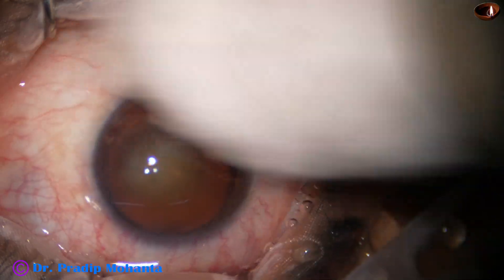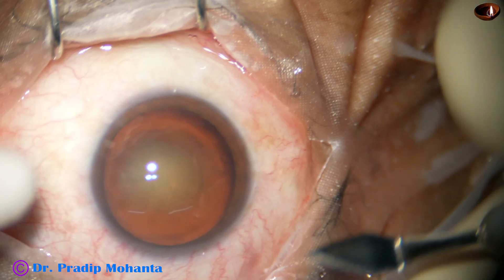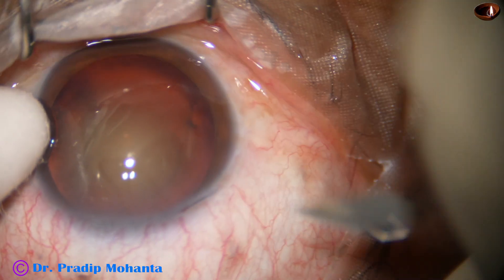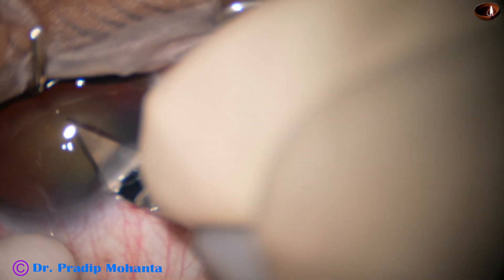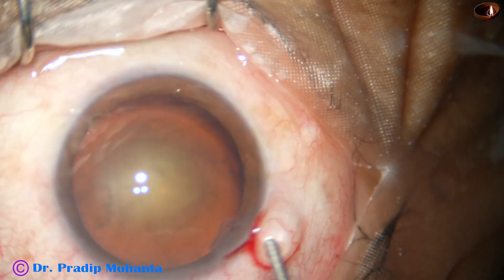The ocular surface is thoroughly irrigated with BSS. Now the main incision. You can make the sideport first if you want. I usually make the main incision first, and I always include some capillaries in the wound.